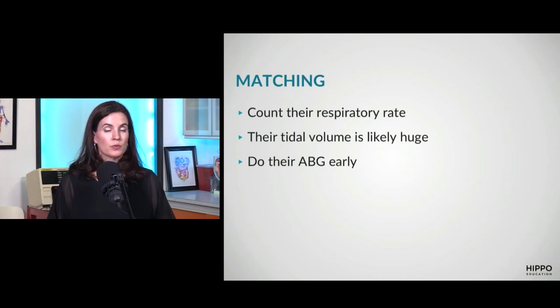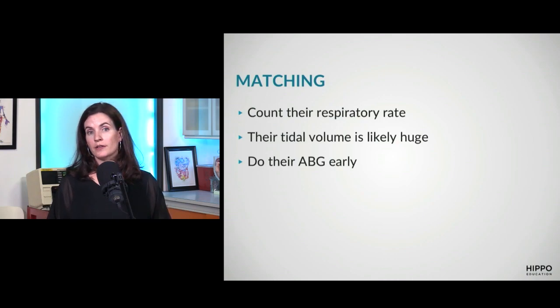And this is the person where I will do a gas within a couple minutes of intubating them. Normally, I'm happy to wait 15, 20 minutes in somebody who's quite stable. In this person, I want to do gases early and often because those first few minutes are critical for managing their acid-base status.